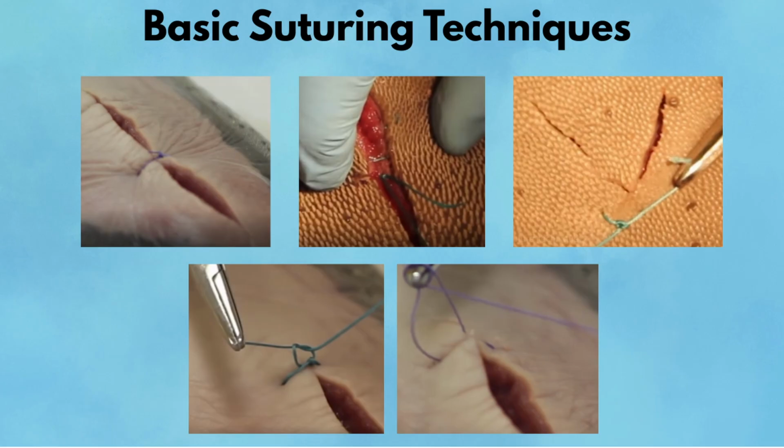We will review the fundamentals of wound approximation before moving on to live examples of different stitch patterns. If you are a medical student, new intern, or early learner in the operating room, this is the core set to drill until it feels automatic. Let's scrub in. Suture basics, eversion and inversion.